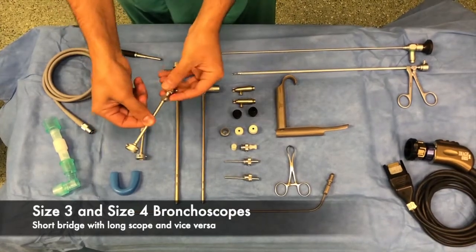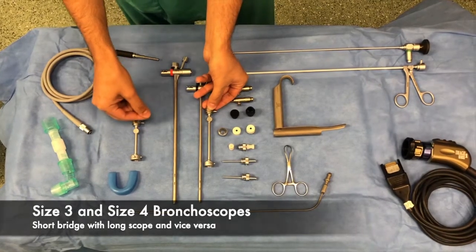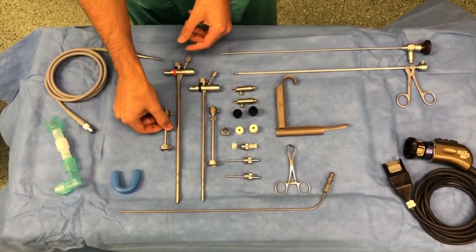There are two bridges available in the set: the long and the short. The long bridge goes with the shorter bronchoscope, and the shorter bridge goes with the longer bronchoscope.